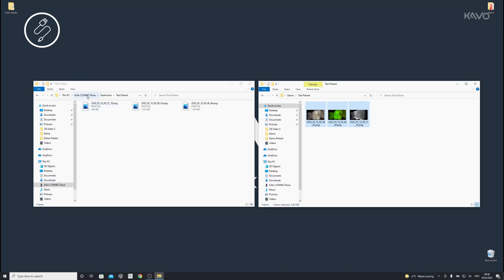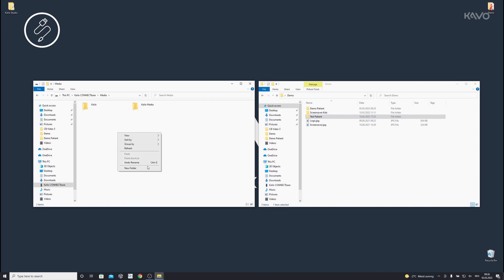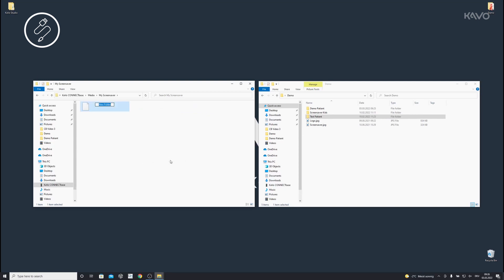To import media, open the Media folder and copy your desired images or subfolders to the Media folder. You can choose any names you like for the subfolders and images within the Media folder.